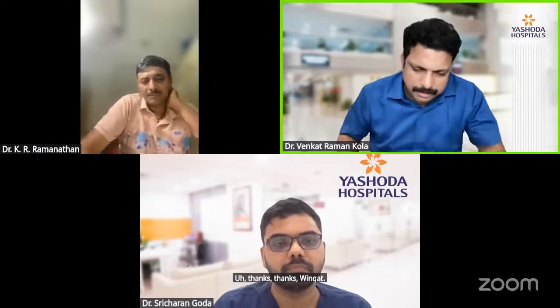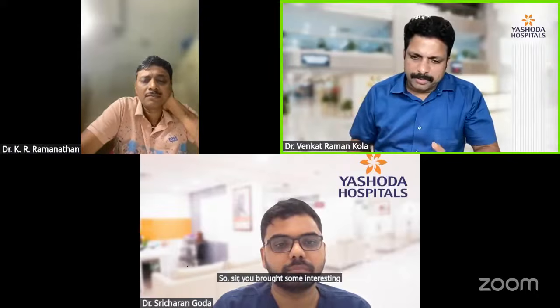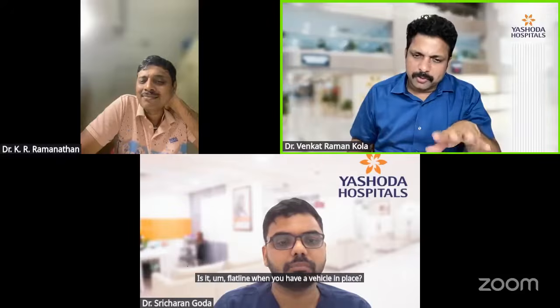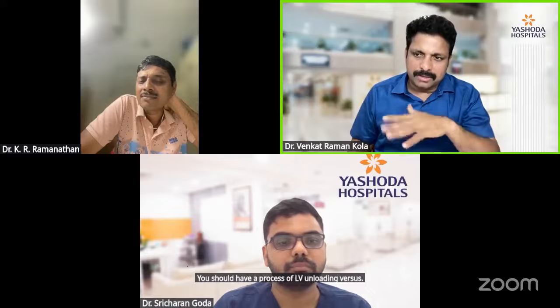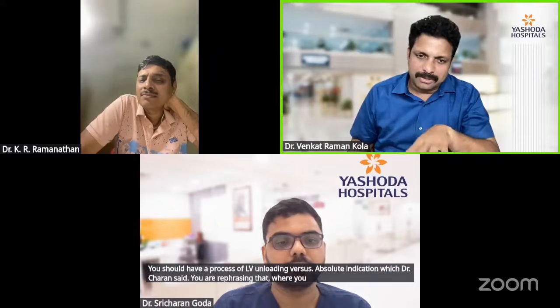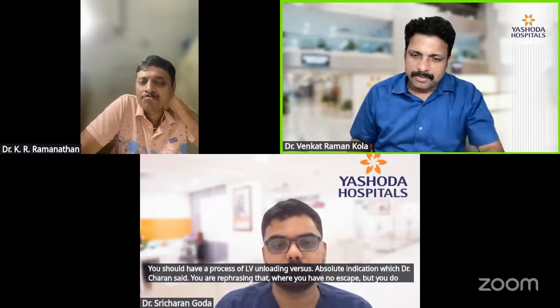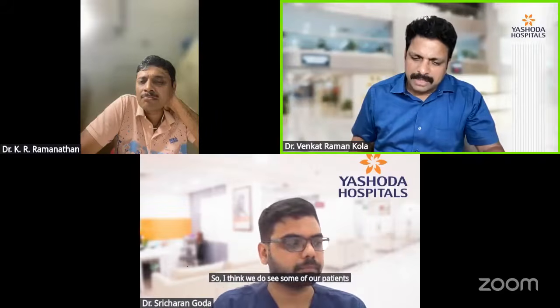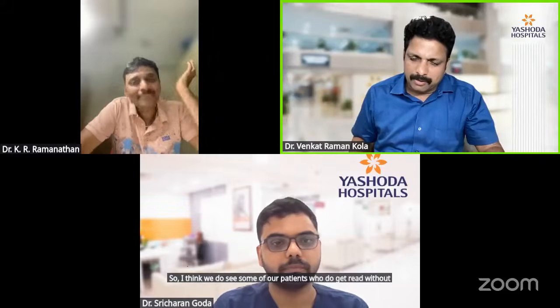Thanks, Venkat. So, sir, you brought some interesting areas of debate. You asked whether an LV unloading process should be in place whenever you have a VA ECMO, versus an absolute indication, which Dr. Charan described and you are rephrasing as situations where you have no escape and you must unload. I think we do see some of our patients who get treated without proper LV unloading.